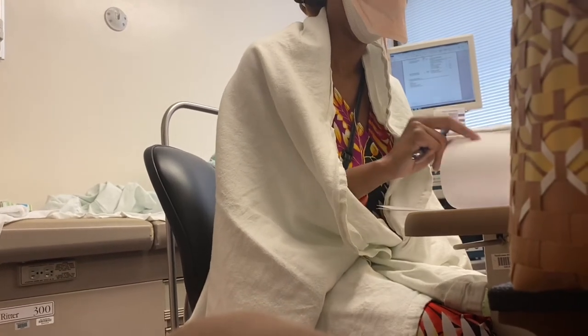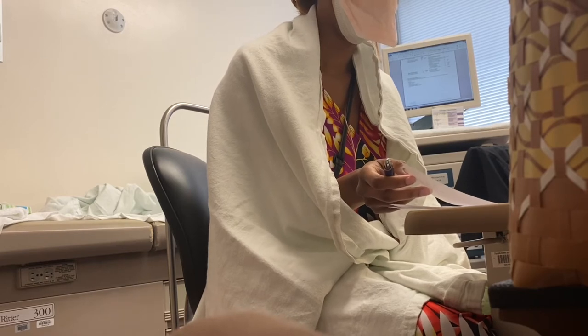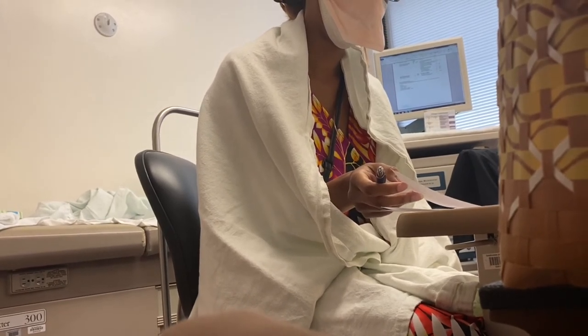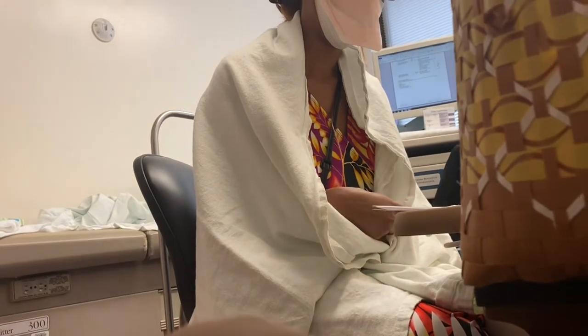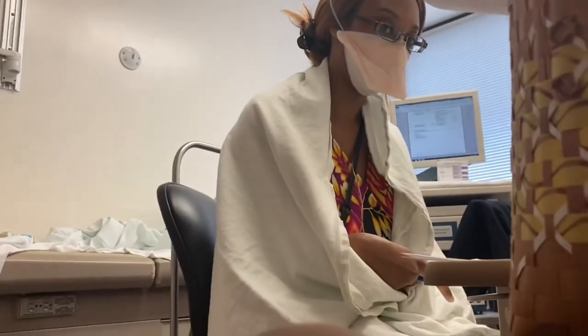Medication instructions on your copy I have marked out, because you're going to take your omeprazole or your pantoprazole, whichever you think you can get down today, and I'm going to want you to please write down the time you take it, and I'll show you where. Monitor instructions: press each button once when a symptom begins. I'm going to show you that. For other symptoms, record the time and type of symptom in the diary.